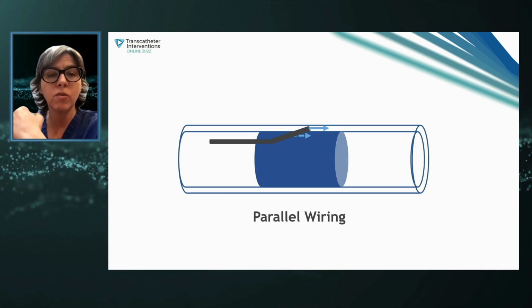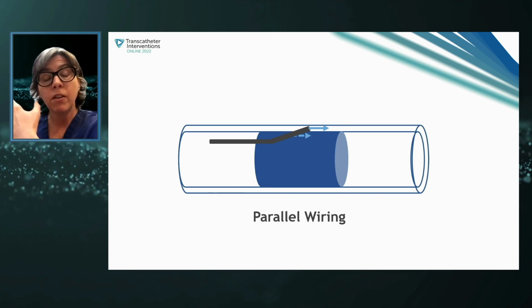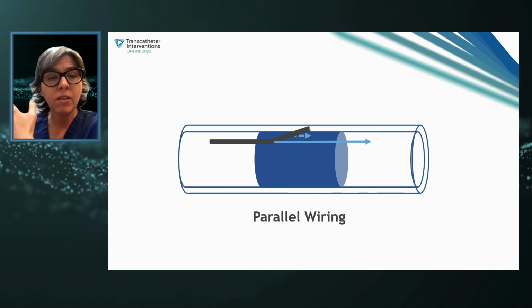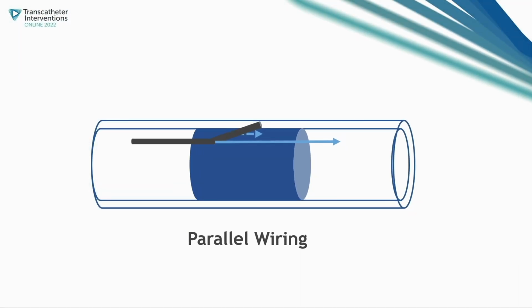So with this device, if your first wire ends up extraplaque, you can take the device in. You then have a second exit port 8 millimeters back from the tip, which you can try. And if that's unsuccessful, you can bring back your first wire and access a second port on the opposite side of the microcatheter, 12 millimeters from the tip, giving you another option for wiring.